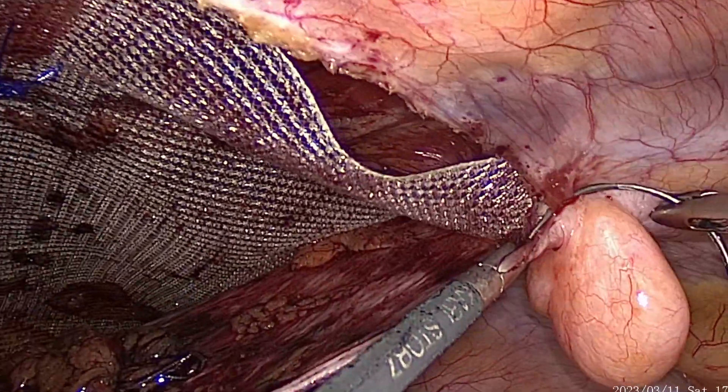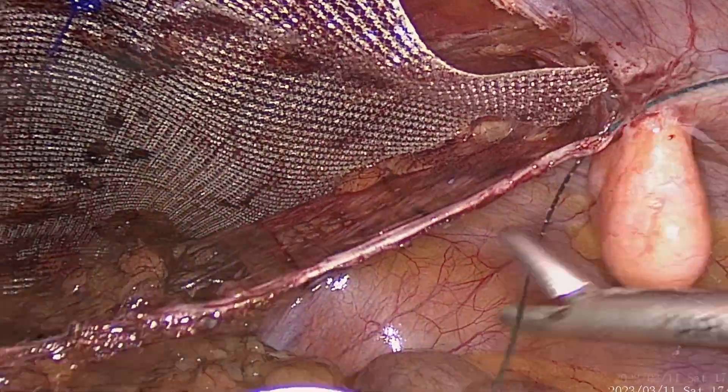A single point fixation is enough, as we feel the mesh gets sandwiched between two anatomical layers of the abdominal wall. The biomechanics of the abdominal wall keep the mesh flat and intact in the same space.